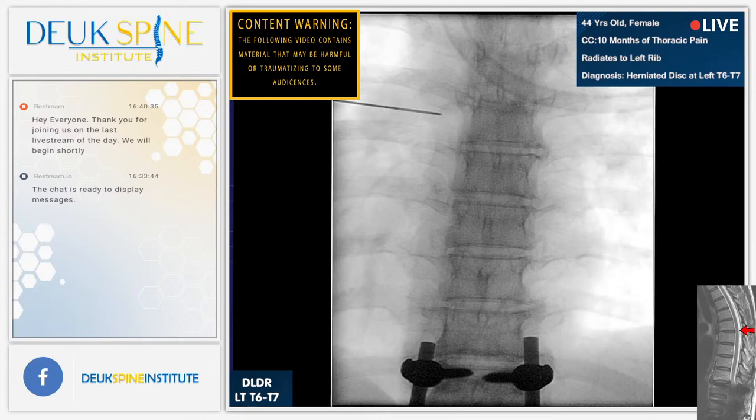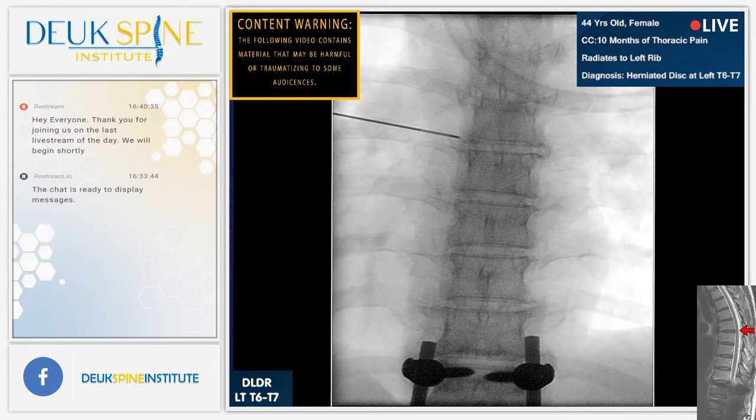All right, good. So we've got 11, 10, 9, 8, 7, 6. So I'm a little higher than I should be. I need to be a little bit lower. All right, so 10, 9, 8, 7, 6, 6, 7. I'm already hitting the facet. Let's go to a lateral view.